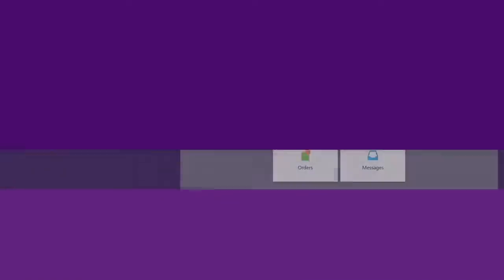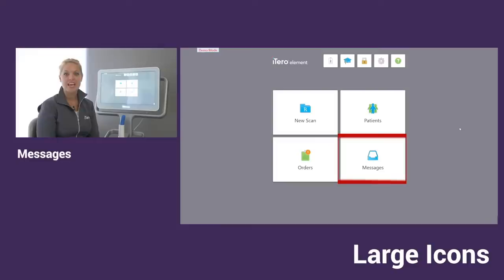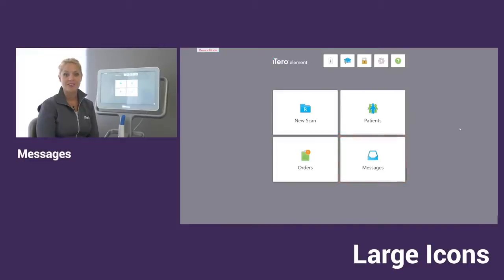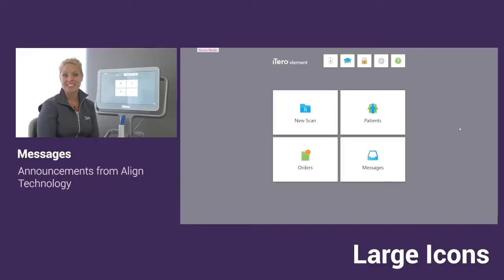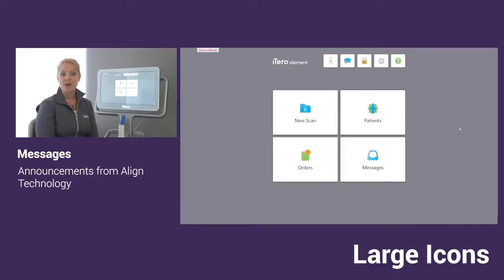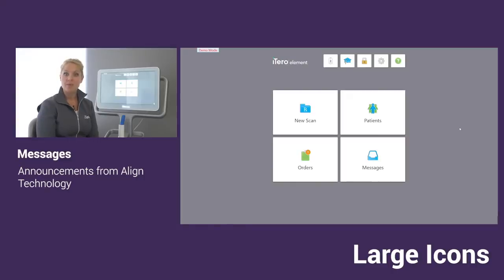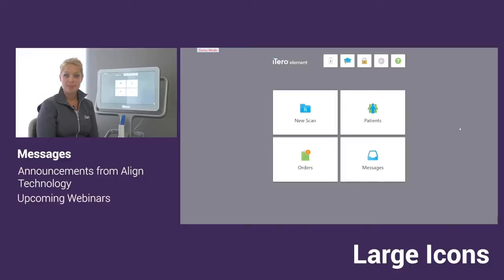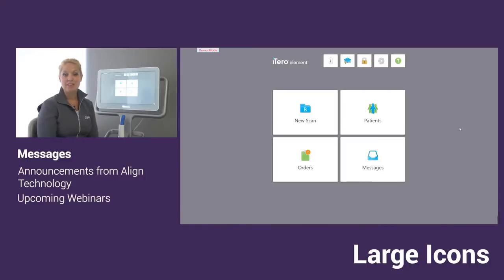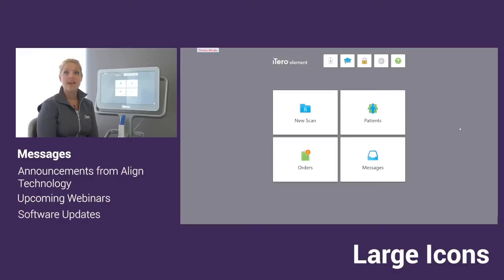Under the patients icon, you're going to see that we have your messages. Your messages won't be specific to your office or your cases, but instead they're more announcements from Align Technology. There are a couple of really common messages that you'll see come through. One of them will be whenever we have a webinar scheduled. You'll be able to read what the webinar is about and register for it. Also whenever we have any software updates, we always provide the release notes so you can stay on top of those changes and know how to use them and be ready for them when they come.